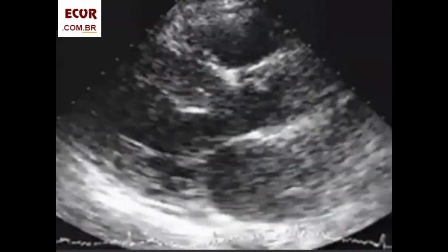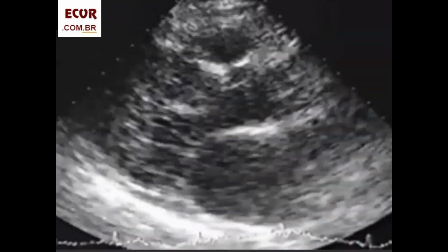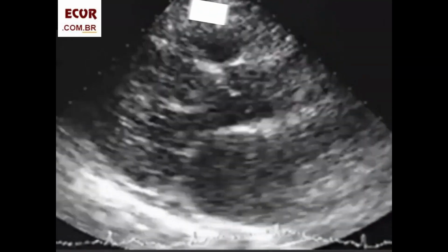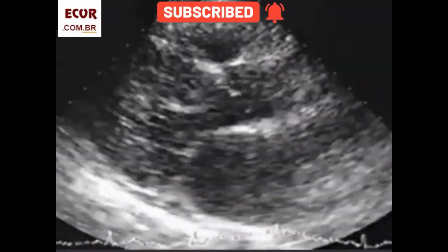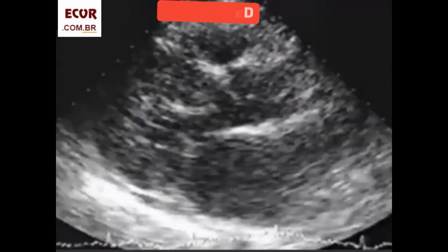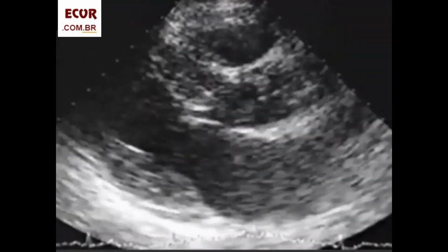I believe this aspect indicates that the endocardial thickening is due to jet lesion and not due to contact attrition with the mitral leaflet.